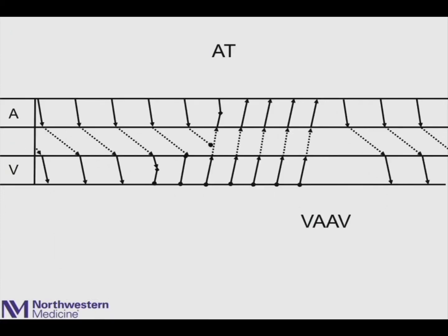This is in contrast to an atrial tachycardia. Even if you mimic an atrial tachycardia in a patient with dual AV nodal physiology with a pacemaker, as we did in this study, you will find that there's only one connection from the A to the V. You'll get block with fusion. You'll eventually, in some patients, not all, get conduction up into the atrium that overdrive suppresses this atrial tachycardia.